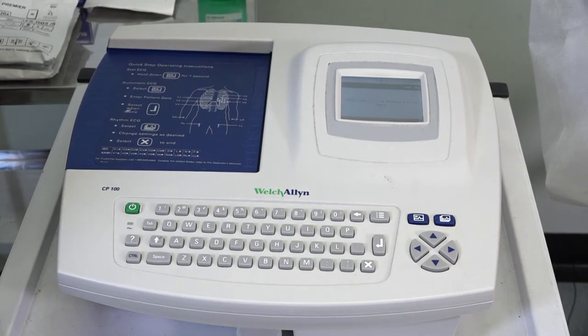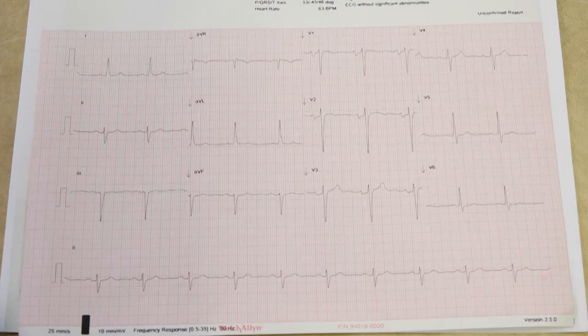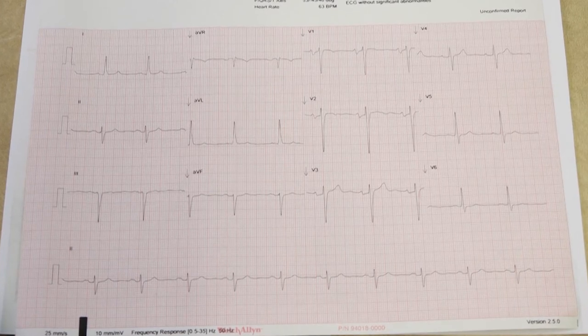Welcome to the UCL Clinical Skills video demonstrating how to record a 12-lead ECG.